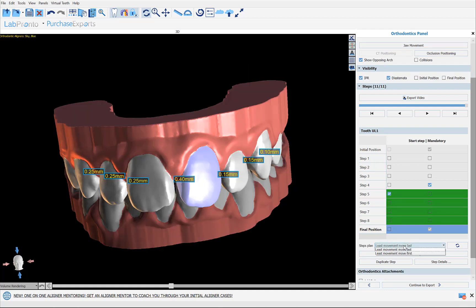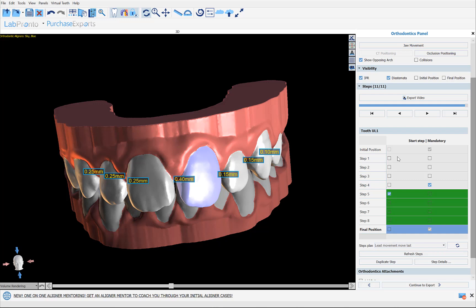We also have a dropdown where you can control the teeth that move the least — if a tooth only needs one or two steps, should those steps happen at the beginning or at the end? You can select Least Movement Move First or Least Movement Move Last, and the sequence will be recalculated. We have, as in past versions, the Start Step column and the Mandatory column. The Start Step column lets you force a particular tooth to only start moving at a particular step.